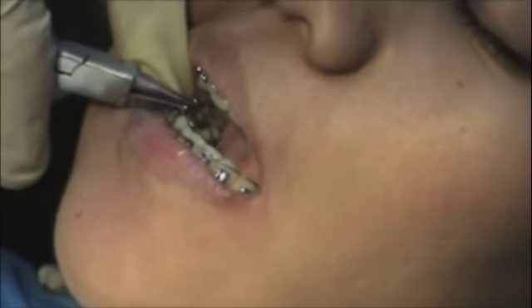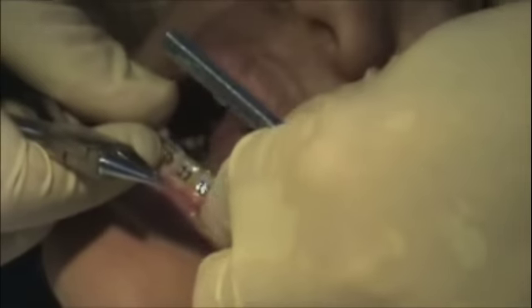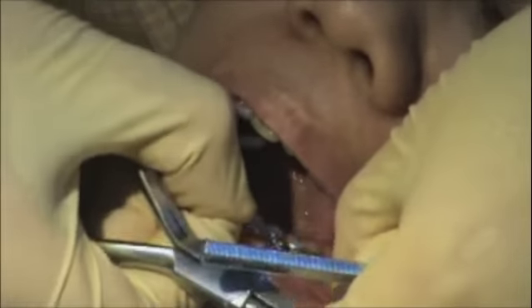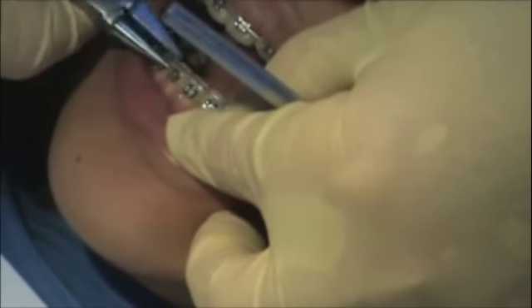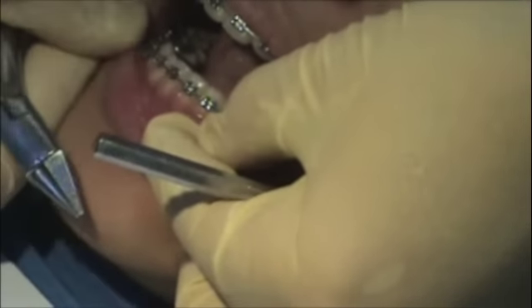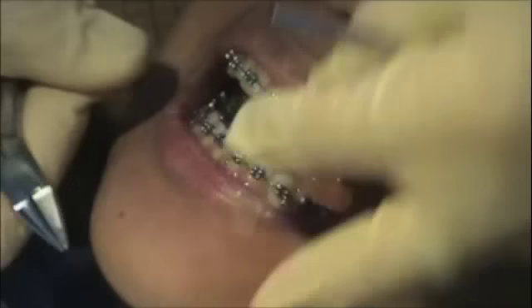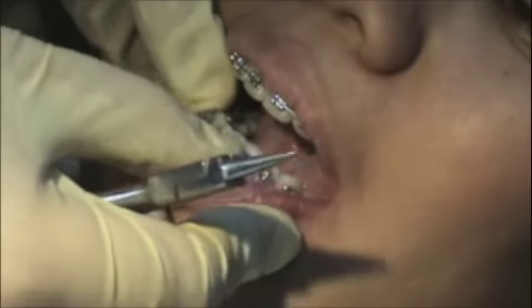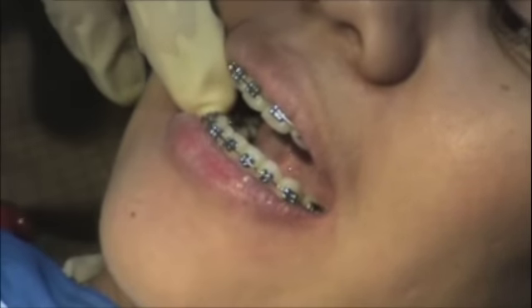What we want to do is make sure that the bends get on the right side. Maybe it's a little short now after some of the bends. I would leave it like this, and I would probably tie in this lower five. If the wire doesn't want to stay in there, I'm going to tie that in. And then if they want, they can pop out the wire on the other side to reposition the bracket.